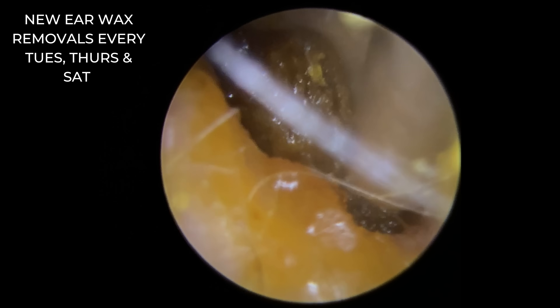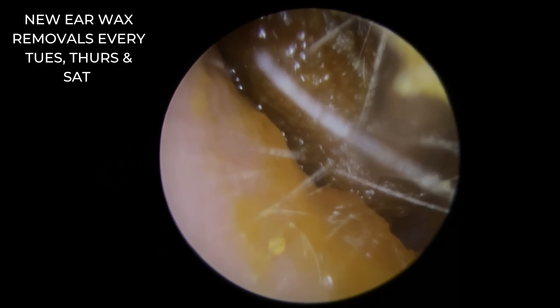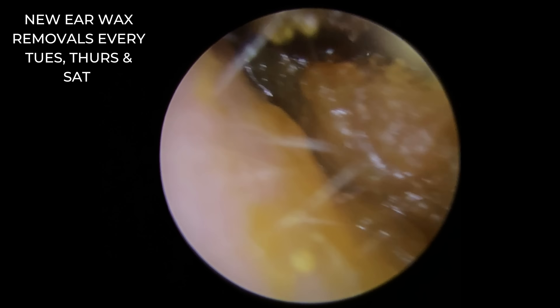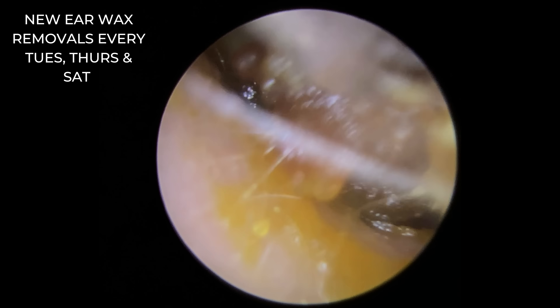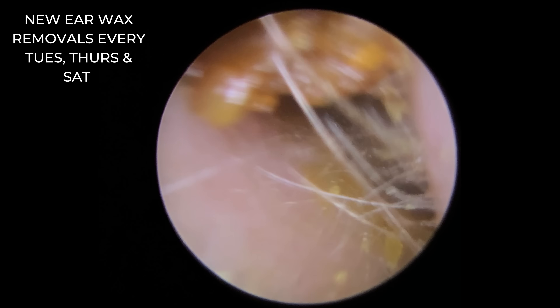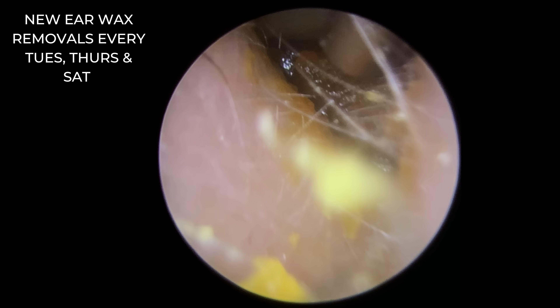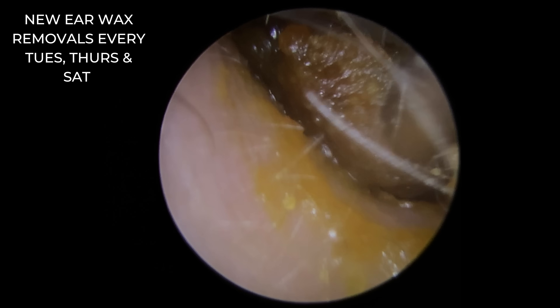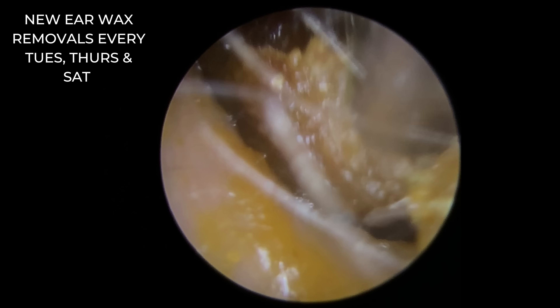Sometimes you'll see the blood vessels start appearing on the hammer bone just because it's getting pushed a bit further towards the surface of the skin. So we've got this very hard lump — you can see we're just lifting from the base of the canal. We took the softer stuff, a little bit more soft wax on the outside edge. That's the piece of wax that the oil has come into contact with, so the wax softening drops have softened that particular part, but they didn't quite penetrate into the central portion of this wax plug. It doesn't really want to budge.